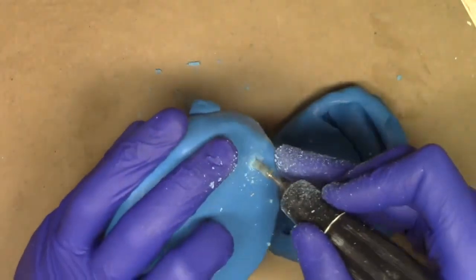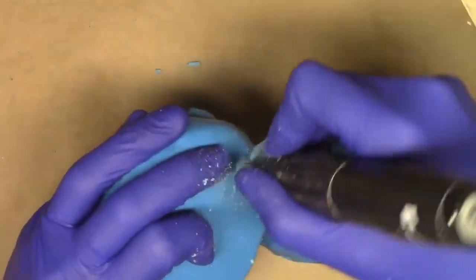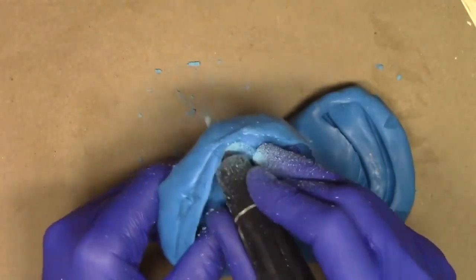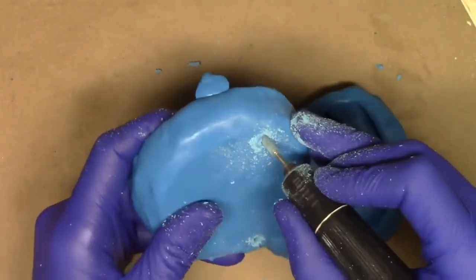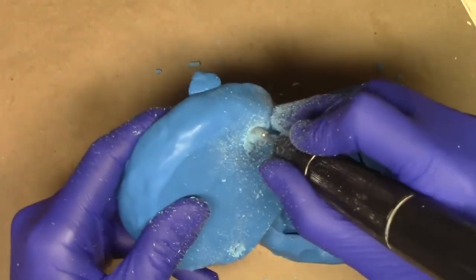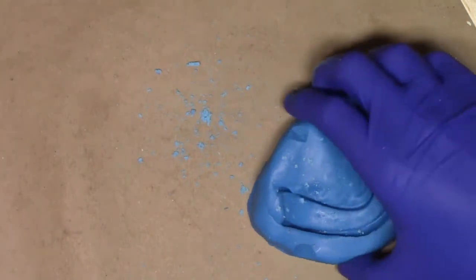And approximately like that. And then take my burr and just round those corners, just like so. Same thing over here, except that this second hole I'm not going to enlarge very large. In this hole I do like to enlarge a little bit more. Clearing this off. And clearing this off.